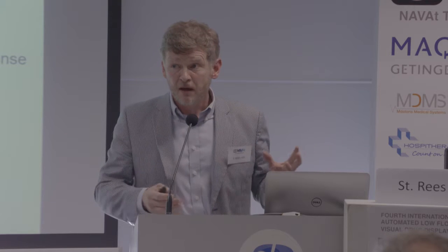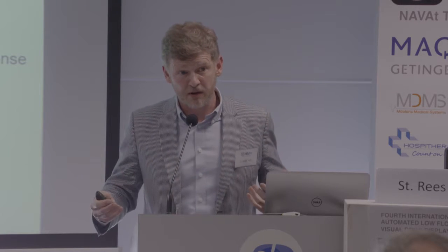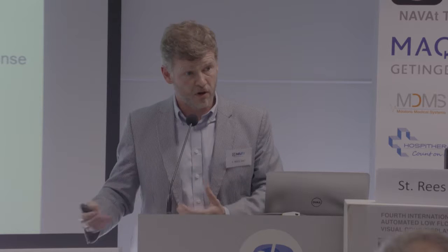If you build such a model and build it into a system, as the patient responds to PEEP, then you can change the model to learn from the patient's response. So if they are a non-responder, you tune the model to non-response as they non-respond. And then the compromise becomes one of applying the correct PEEP to achieve the appropriate oxygenation without too high pressures, dependent on the patient's response or not. And the compromises happen naturally.